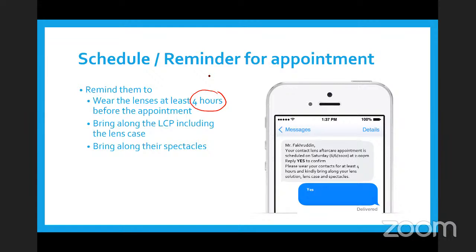We also need to remind the patients to bring along their lens care products, which includes the lens case and their lens solution, because at the same time we are going to evaluate how the patient is using these lens care products, how the patient is using the lens case. And not only that, but sometimes the patient has been advised to use a specific lens care product which you may not have in your clinical practice. So you want the patient to bring those lens care products so they can continue using them in front of you, because you want them to remove the lenses.